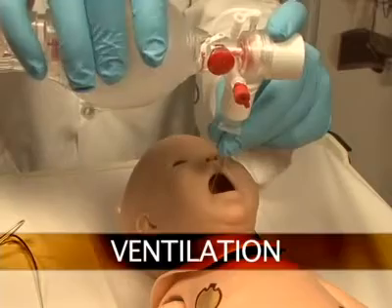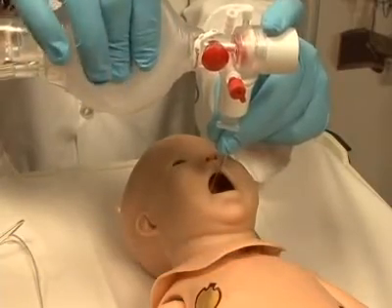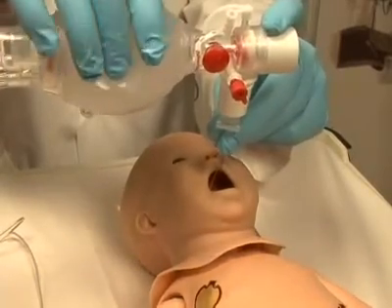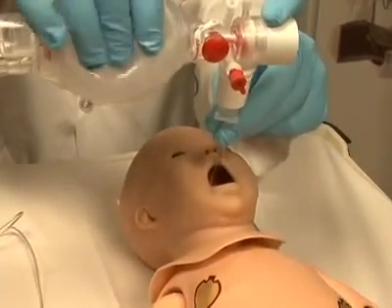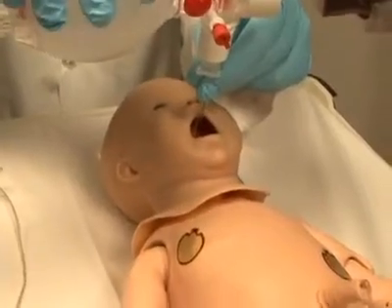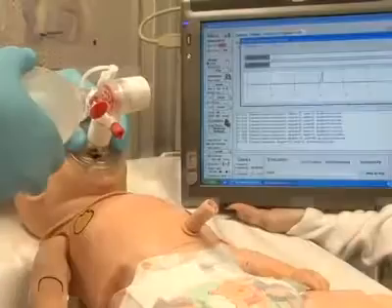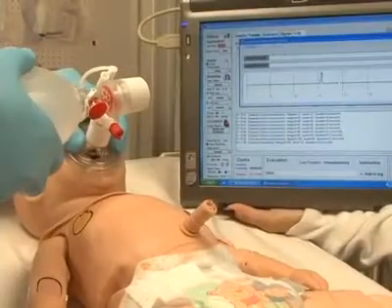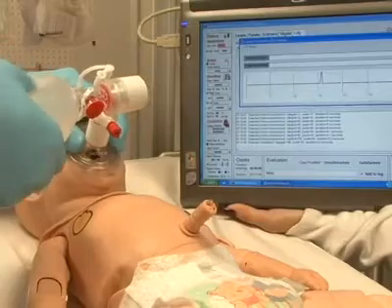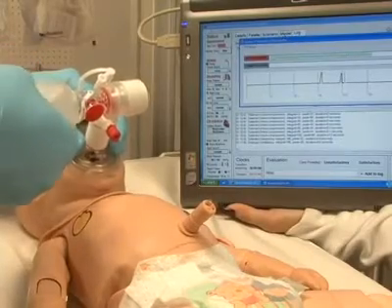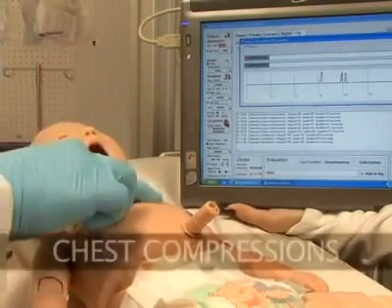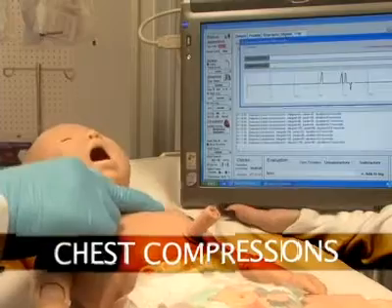Newborn HAL can be ventilated with a BVM or a mechanical ventilator. Ventilation and manual chest compressions are measured and logged showing the instructor exactly how students are performing.